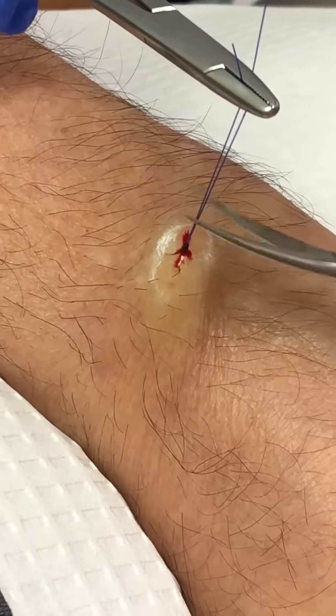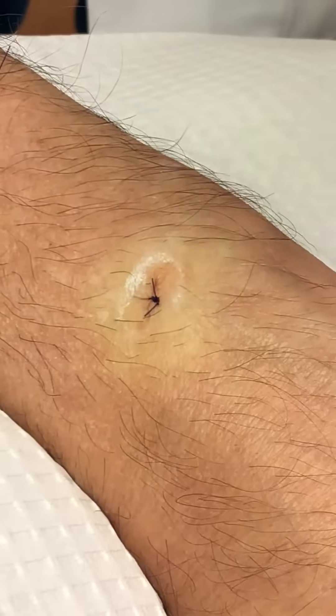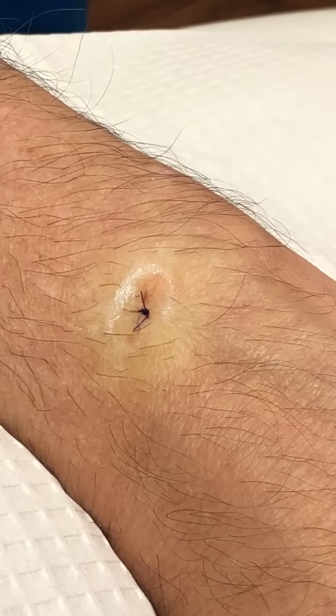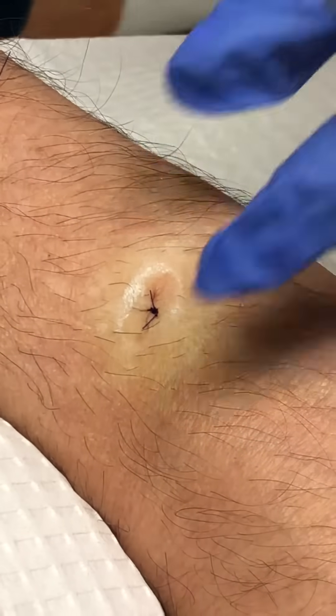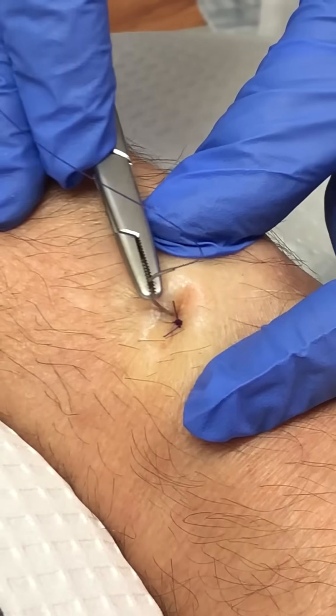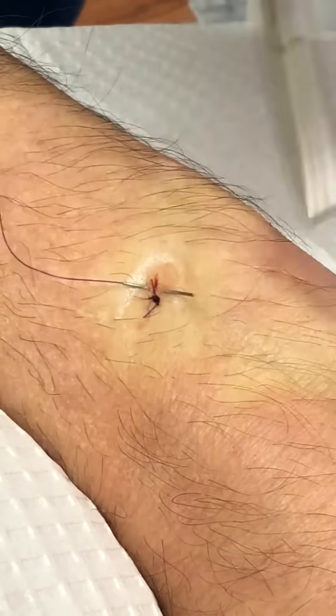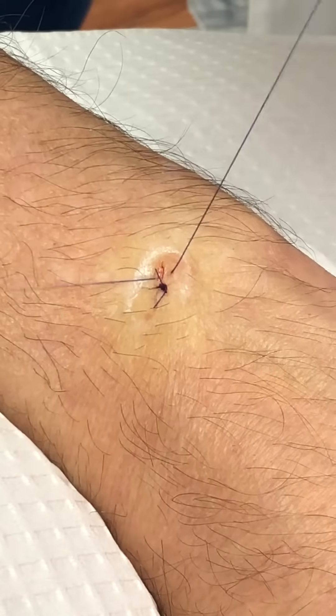There we go. You're doing very well. Are you having any discomfort? No, not at all. And we have a wonderful patient here because he's not bleeding. Typically this is how it goes — most people don't have a lot of bleeding.